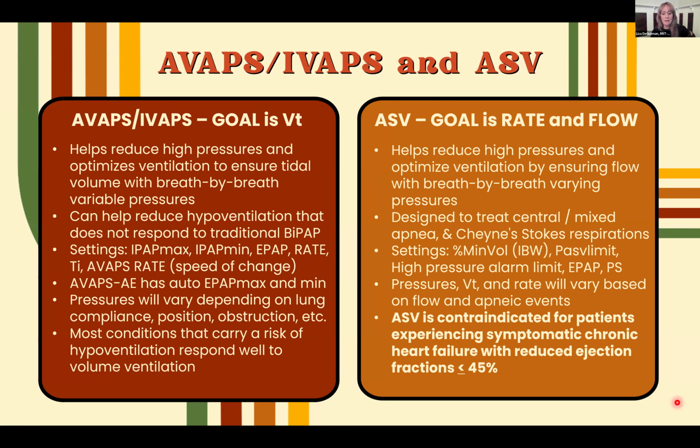AVAPS and iVAPS. Here, the goal is volume. So it helps reduce the high pressures. We have a lot of patients that transition over to volume ventilation. Keeps the pressures low, ensures a set tidal volume.